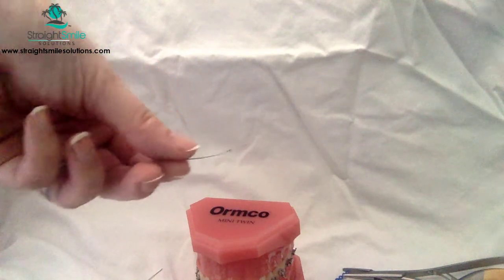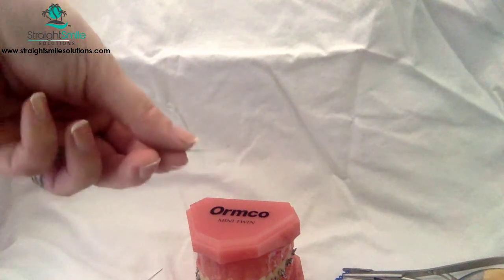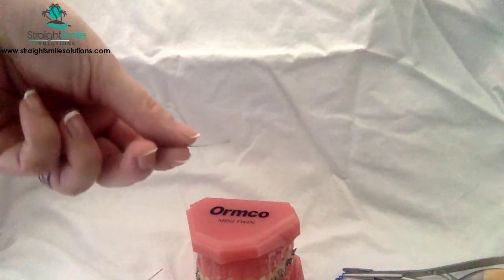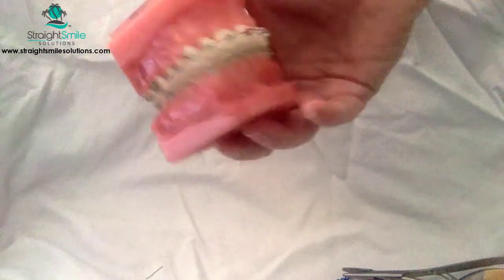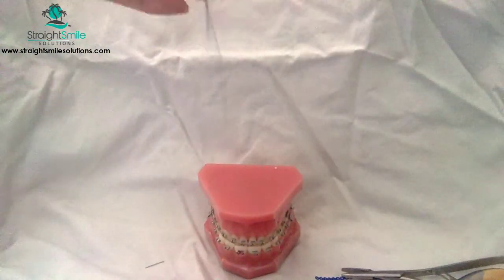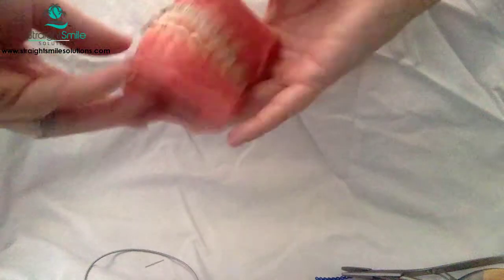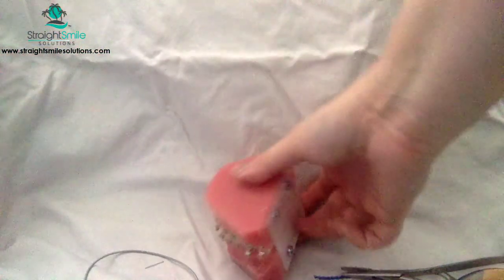So now what I want you to do is practice not only cinching a sectional wire, like 2 to 2, but cinching a whole wire in the mouth. Make sure you take pictures of both exercises: front, side, side, as well as top and bottom. So there should be 5 pictures per student per exercise. That's 2 separate exercises, a 2 to 2 wire and a 6 to 6 wire.